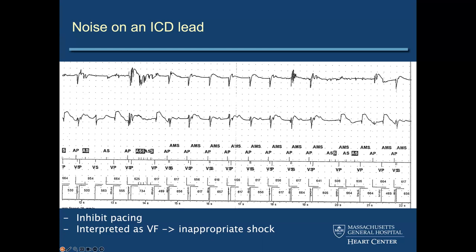So it's not the kind of noise emission on the ventricular channel. It's not oversensing atrial noise. It's actually just happening to align an atrial pace with a true ventricular event. At least that's my interpretation of it, causing it to safety pace as a result. The reason why it's such a short window there is to avoid any kind of pacing in T waves. You see where it's pacing, it's aligning with the QRS complex. I mean, there could be some vulnerable pacing here, and I'm not an electrophysiologist, but it's kind of a defense mechanism of the device to avoid withholding a ventricular pace. And in those cases, with a patient being dependent, that can be very dangerous.